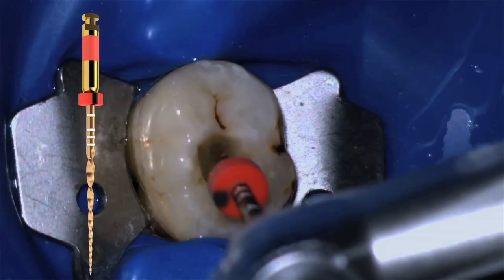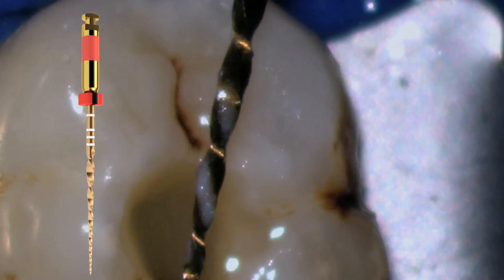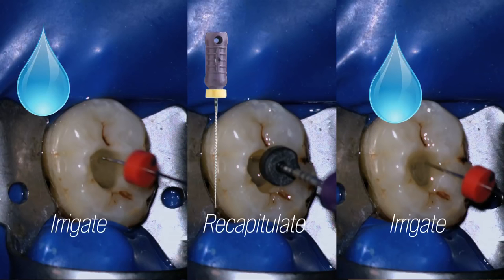That's the amplitude stroke. Every 3 millimeters, we will remove the file, observe the file for dentinal debris, clean those dentinal debris, and irrigate. Every time that we irrigate, the needle will be penetrating deeper and deeper into the canal. After irrigation, we take the file that we established the working length with, and we ascertain that we have not blocked ourselves. In other words, we are going to recapitulate.